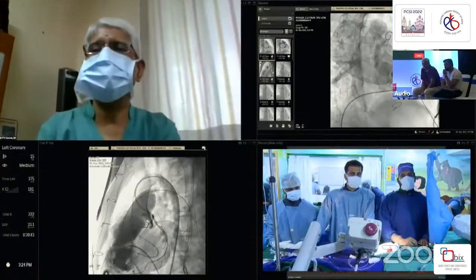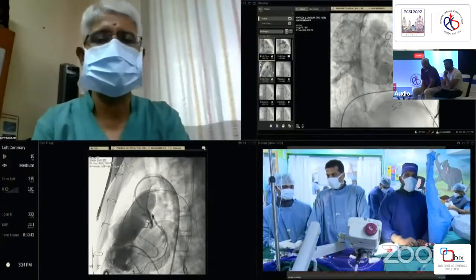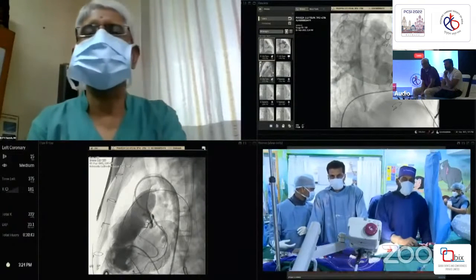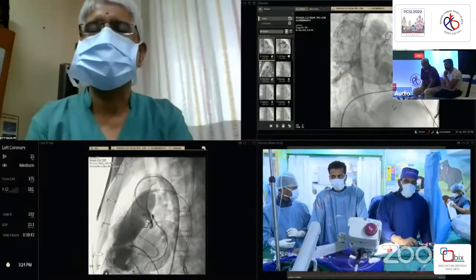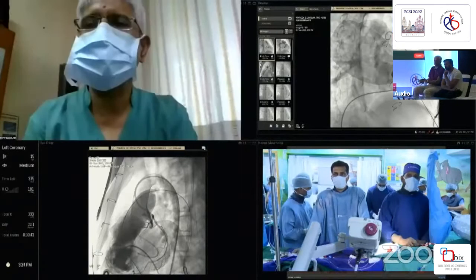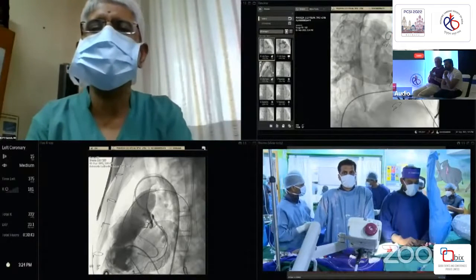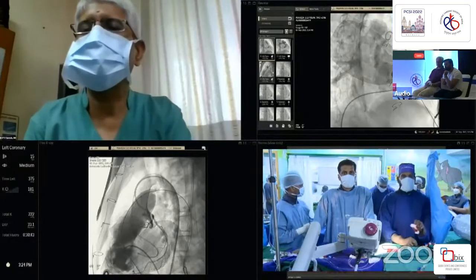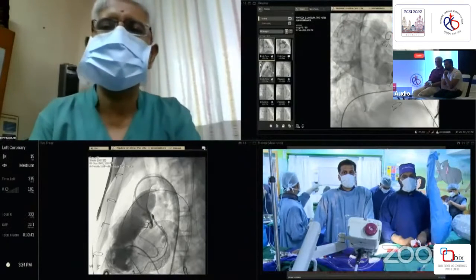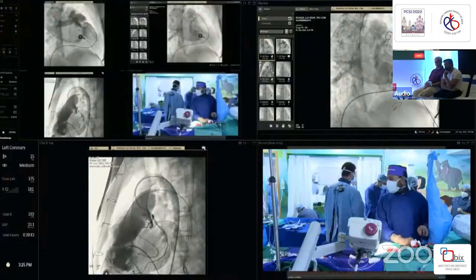I think the downside of not pacing is you will not get a good seal, the balloon will keep on going back and forth. Yes. You will never have the right size. We have done that and it is a problem actually. The balloon doesn't stay there at all. However much you try, unless you do rapid pacing, it is just not possible to get the right diameter. Yeah, from whatever experience we have of assessing the RVOTs without pacing, more than a dozen cases, all of them had big RVOTs, all of them were native RVOTs with TAPs, and we couldn't hold the balloon there, whatever we tried, and they were all very big.